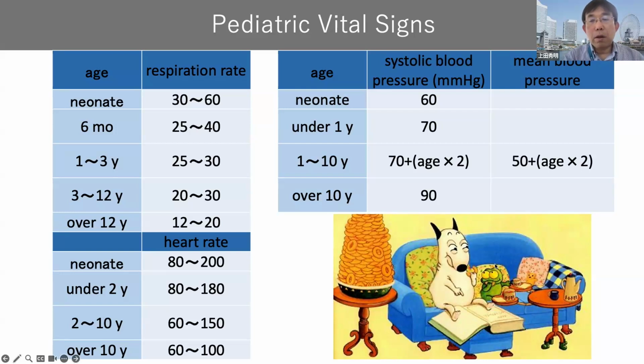So we always consider which age category the patient belongs to. Each patient has a specific normal heart rate, specific systolic blood pressure, and specific mean blood pressure.